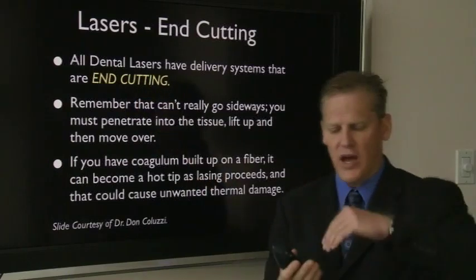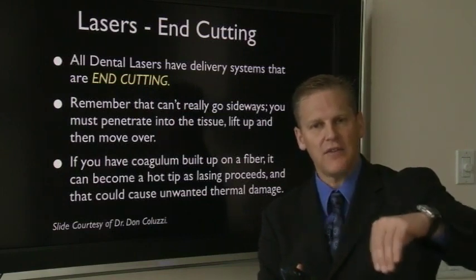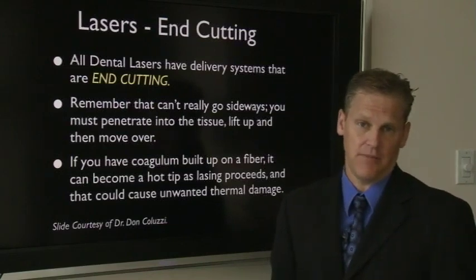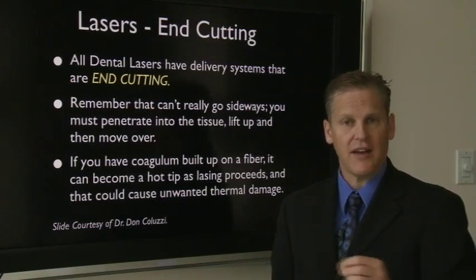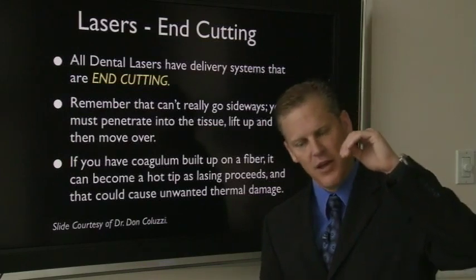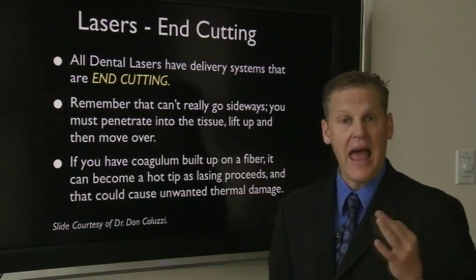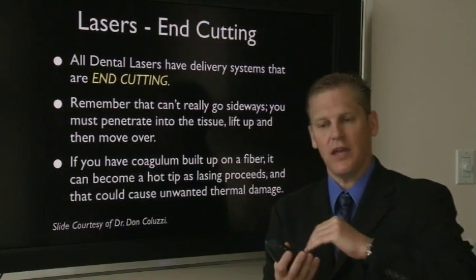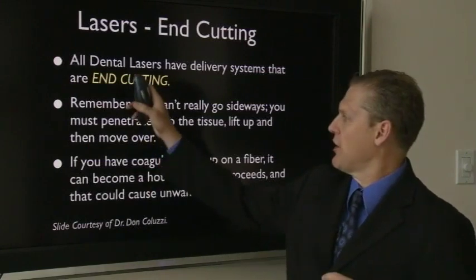What this means is that you have to let the light do the cutting. The physical act of dragging the tip through will not do your cutting, and in many instances can increase the amount of bleeding. So you have to be patient, use slow, small brush-like strokes, and allow the light to do the cutting, recognizing that the light is in most cases penetrating directly down. If you initiate the tip and the sides of a diode laser, you can get some of the energy being transmitted laterally in the tip itself, but for the most part, all lasers are end cutting.